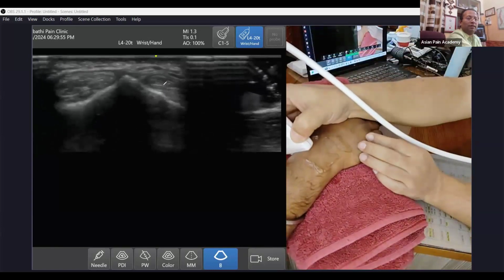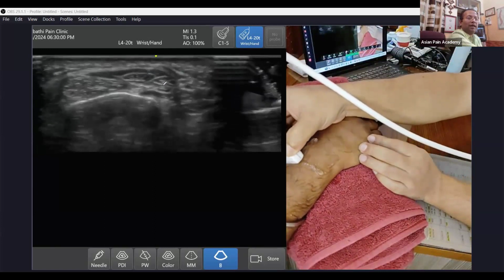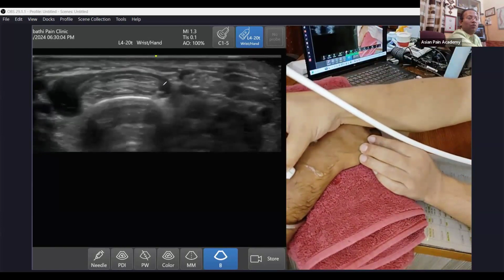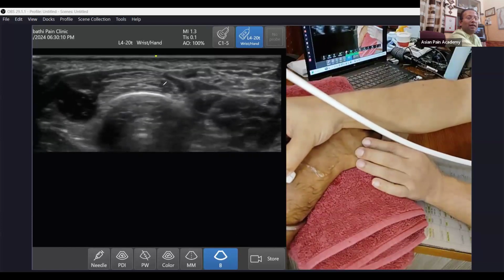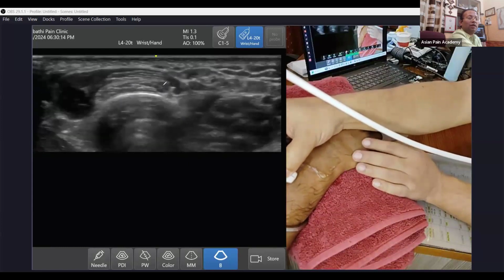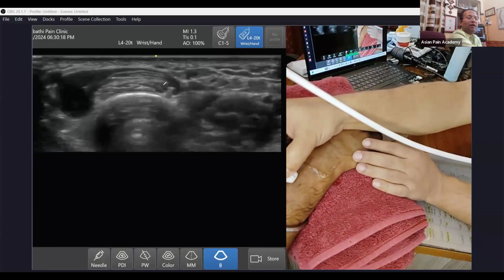So remember, this is compartment number 1 and 2. When I go proximally, it is passing from above compartment number 2. So there is some area, say this area, you can see both tendons rub each other. One is traversing over another, both tendons are rubbing each other.